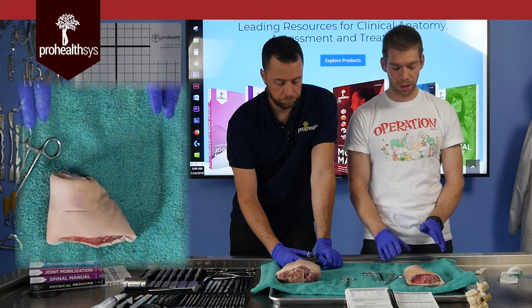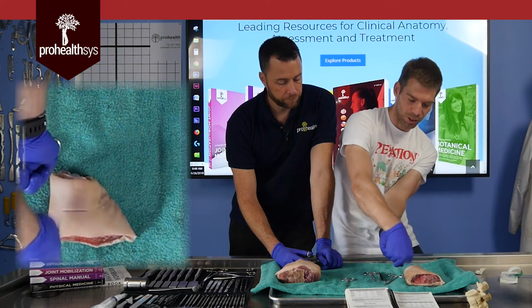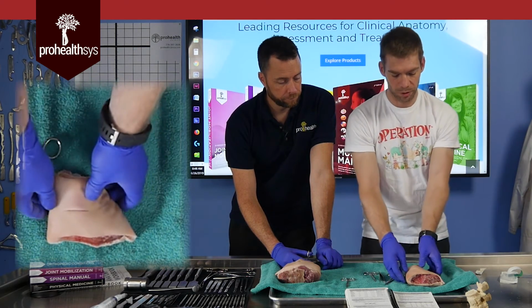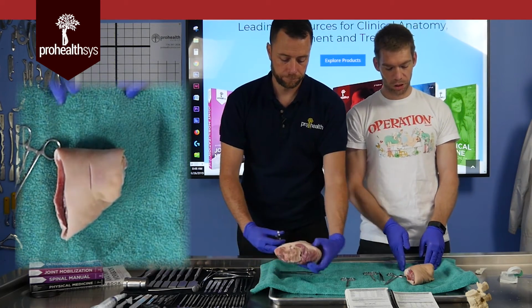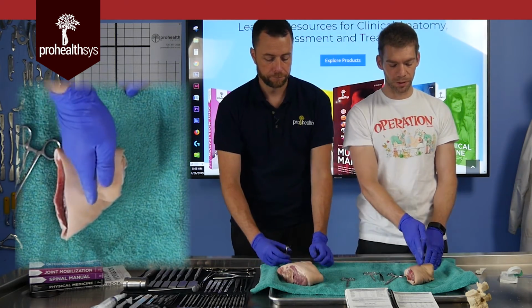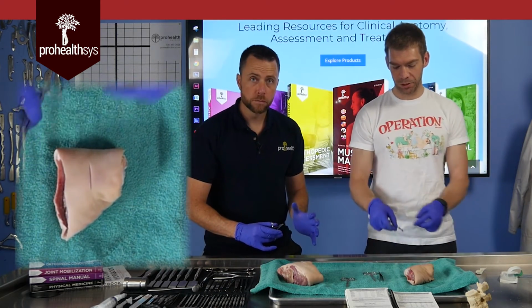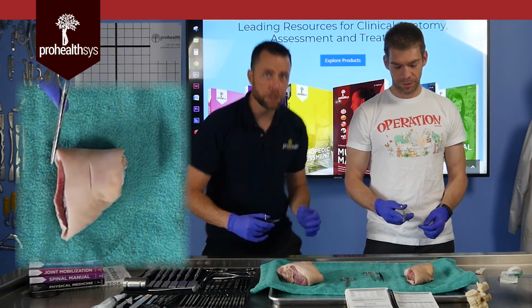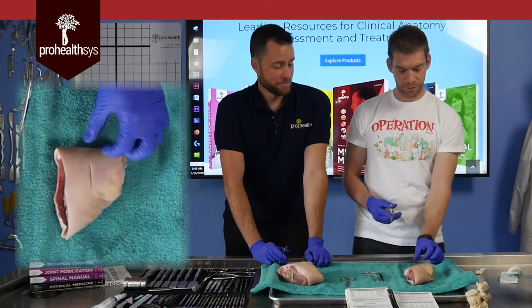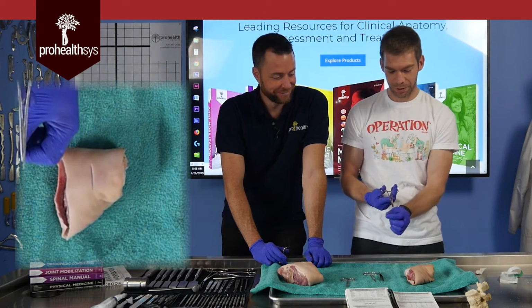The next thing I want to do, I don't want to work with this patient in this direction because I'm going to be working against myself. It's very annoying. So I'm going to change my patient orientation. When the laceration you're dealing with is perpendicular to the plane of your belly and your hips, naturally you're squared up. Maybe an athletic stance. You want to get in there, be ready to move. That's right, in case the anesthetic didn't work, and the patient gets upset and assaults you, be ready.